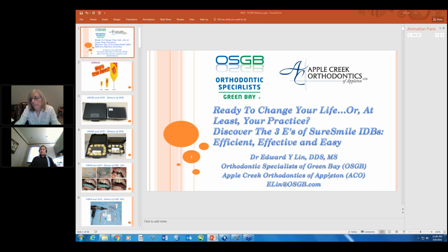And that gives us time to have SureSmile clean up the intraoral scan and segment, which they guarantee back in 1 to 2 days, and for us to do the plan. Right now it's just me, but in the future it's going to be our digital lab techs. And then I think they guarantee 5 days that they'll have the indirect bonding tray 3D printed, and then you've got to account for shipping. And we live in Green Bay, Wisconsin, the frozen tundra, so there can be disruptions with snowstorms and stuff like that. So we just schedule 15 days just to be certain.